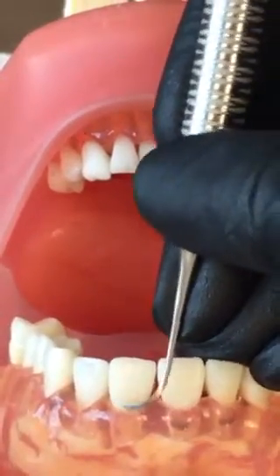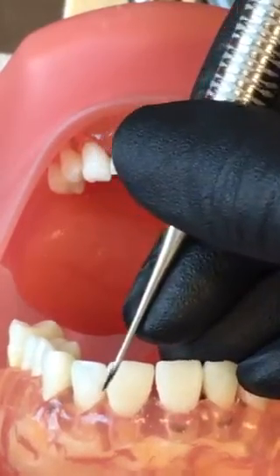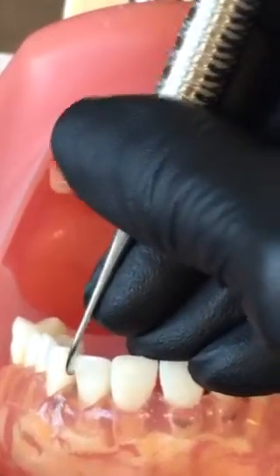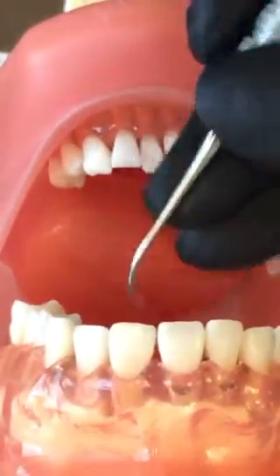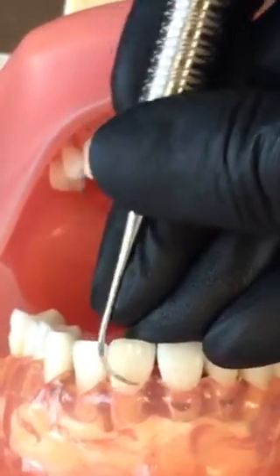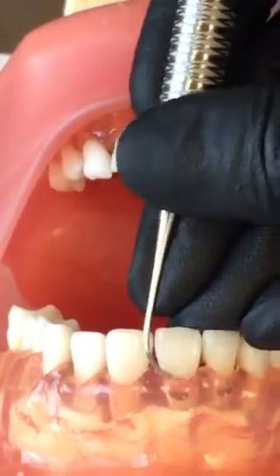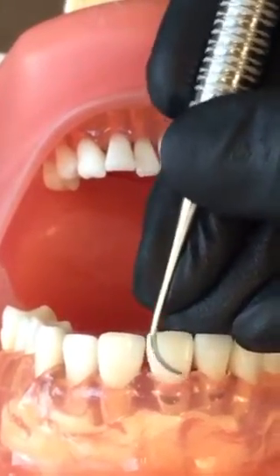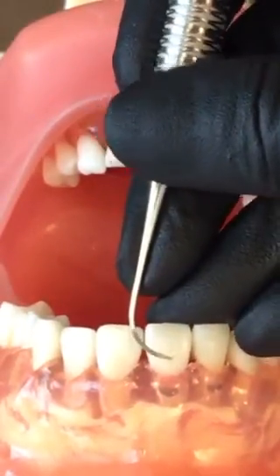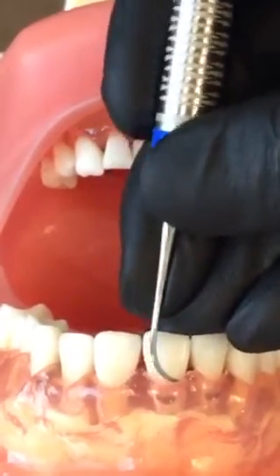On these anterior teeth there's not much width to them, and so you must roll very, very quickly in order to not cause any tissue trauma. For the surface towards you, you're going to flip your instrument, leading the opposite way, start midline, and roll. Remember, you've got to lean down to engage your blade. Think of your handle as being an extension of the tooth — keep it as straight as you can while you're scaling.